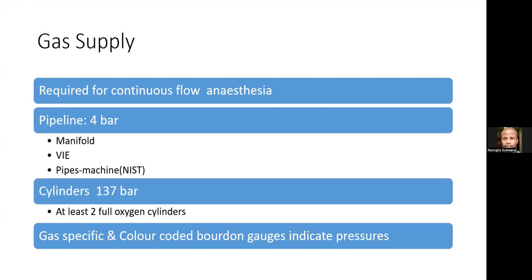So this oxygen needs to be continuously used so that there's no buildup of pressure from that oxygen, which is continuously evaporating because of latent evaporation. If the pressure builds up, yes, there's a pressure releasing valve. If it's not used for about a week, the pressure builds up so much that the releasing valve has to release oxygen into the atmosphere, so there's no explosion from the pressure buildup.